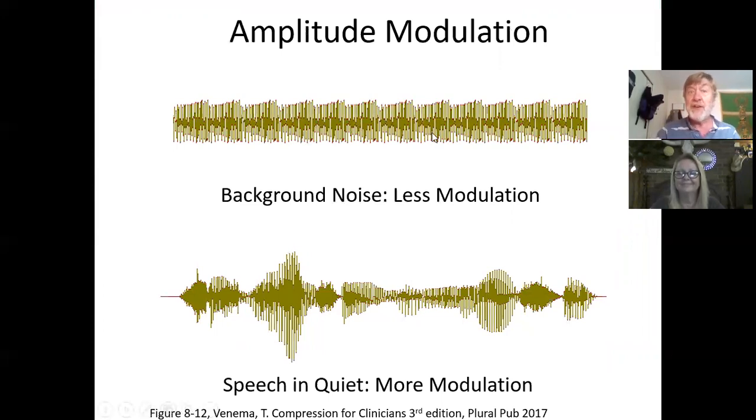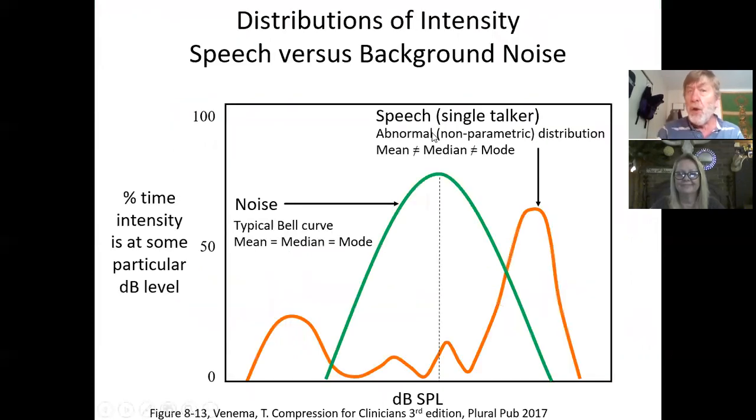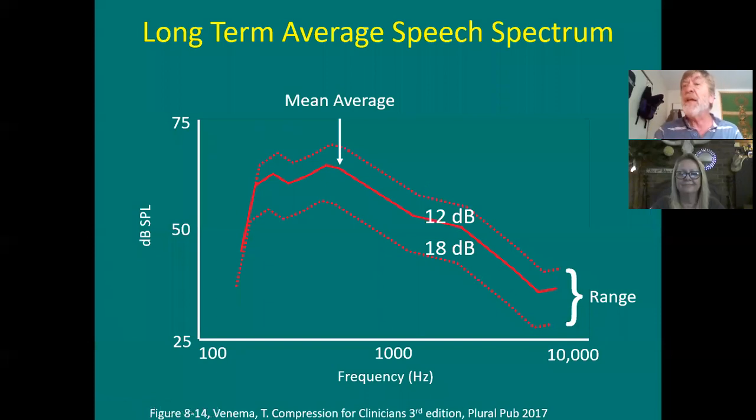And if the sound is like the top coming in, oh, it's got a fairly normal distribution of speech intensity. Most of the time, it's at this particular intensity. That must mean it's noise. Reduce the gain. Okay? And that's how your hearing aids are using artificial intelligence. They literally are. They're using math. They're using statistics. They're looking at the waveform. Is it choppy? They're looking at the distribution because it's all math. That's what digital algorithms are.